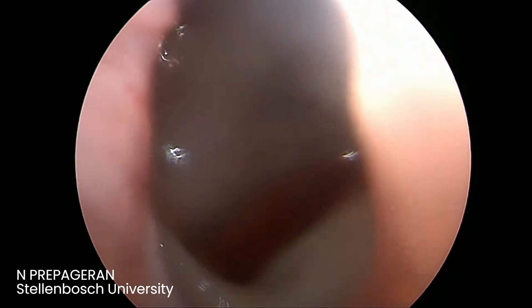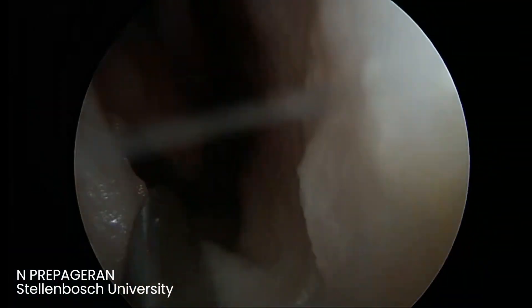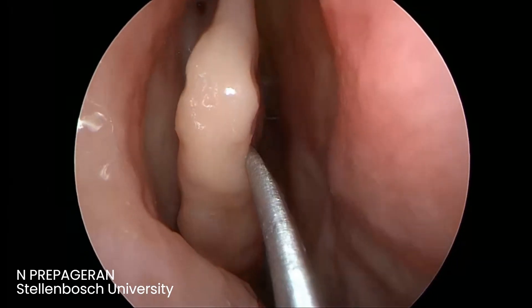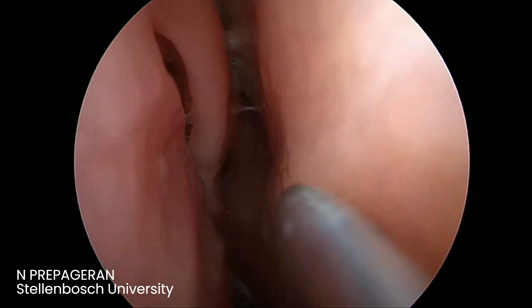That's the optimal surgical result. That is module 1, that's the first step. If you want to do a functional sphenoidotomy, then if you notice, we have not touched or damaged anything. None of the mucosal structures are touched — it's what we want to do.